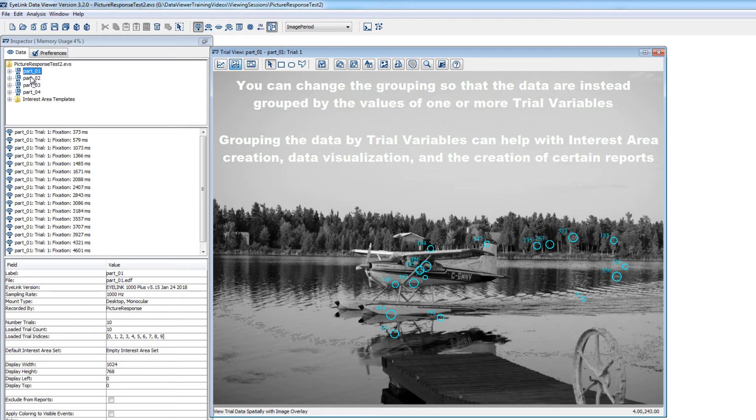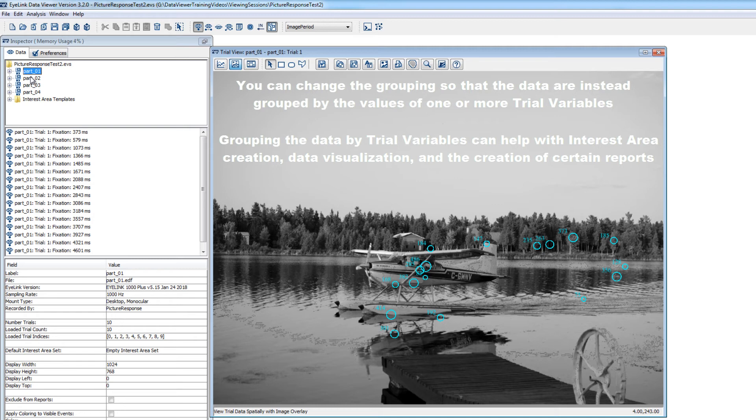Doing so also allows you to create data visualizations for all the trials with similar values of a trial variable, revealing differences in eye data patterns across conditions or groups of participants. And finally, grouping the data can allow for the creation of certain aggregate output reports that are collapsed across conditions.